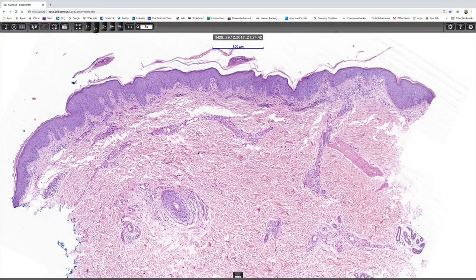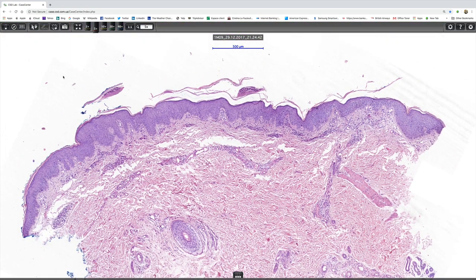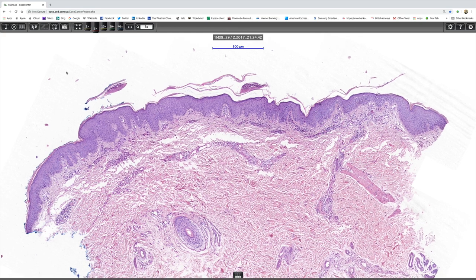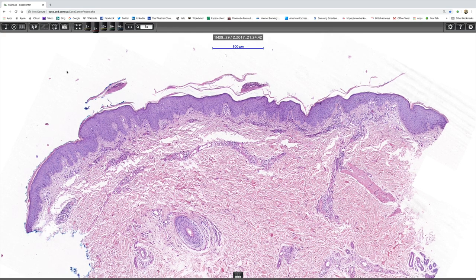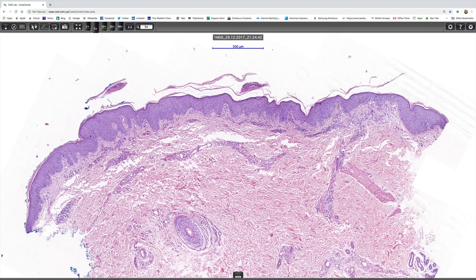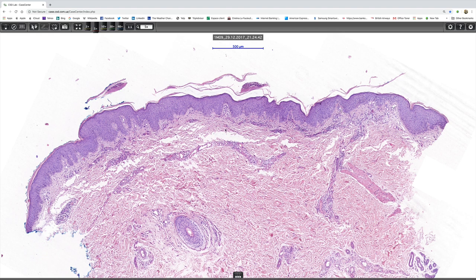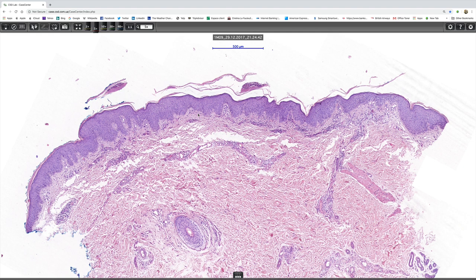So here we go. Now, this is really very nice. We'll have to assume that this edge here is sort of the normal thickness of the skin. And so this epidermis is certainly acanthotic, the semi-longation of the reti ridges. I don't think we're getting thinning of the suprapapillary plates, but we can notice right in the middle and over there and over there, there are prominent dilated papillary dermal blood vessels.